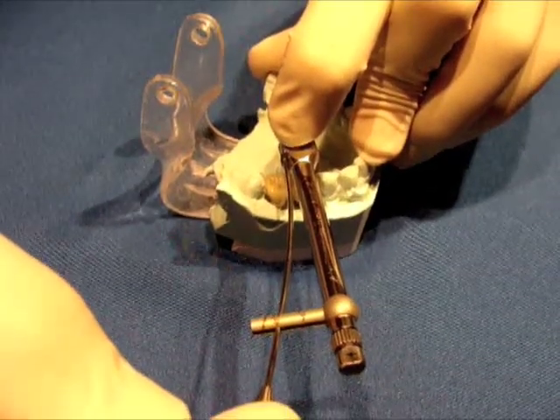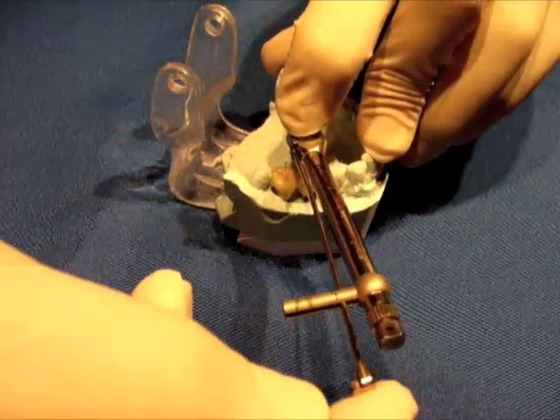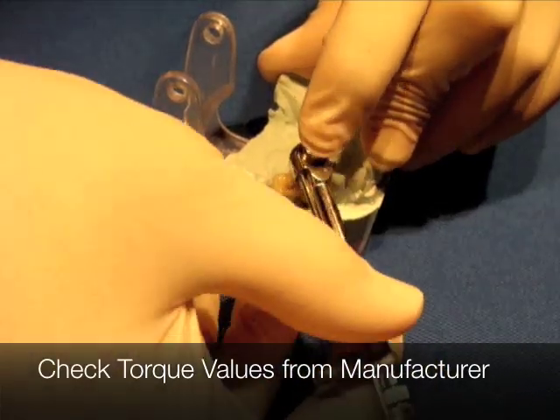As I do that, I'm not touching the arm — we don't want to touch this part here. We want to only touch this teardrop shape on the end, and that's what's going to tighten the crown down. So we do that again on the other crown.